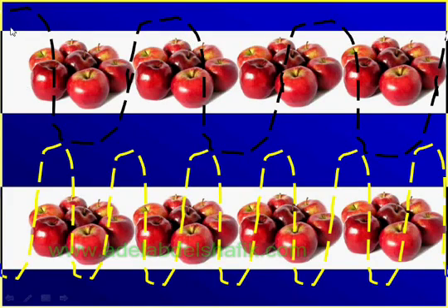Now imagine this is ultrasound and we get waves passing through this apple, so it will send information back to the transducer. So I will understand that there is an apple here at this location. Then on coming up, I will understand there is another apple here, another one here, another one here, and I'm going to miss the apples in between. In the lower row, the wavelength is short, so you get waves passing through each apple, every apple.